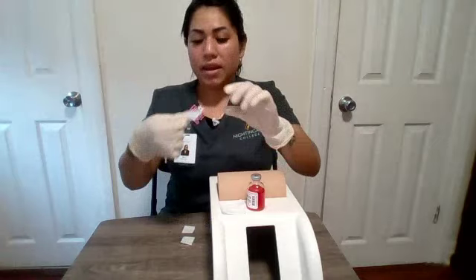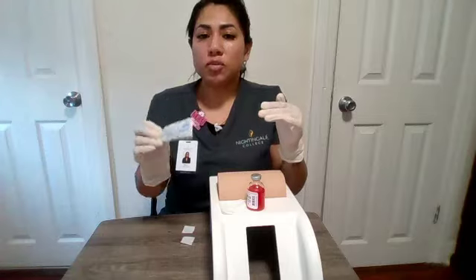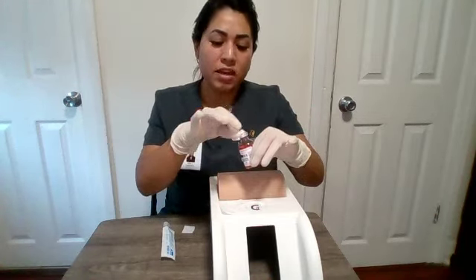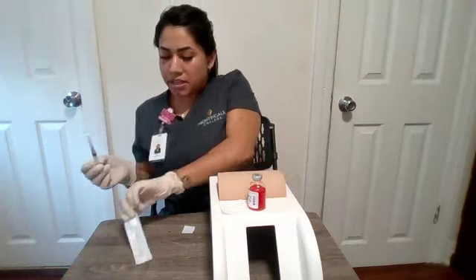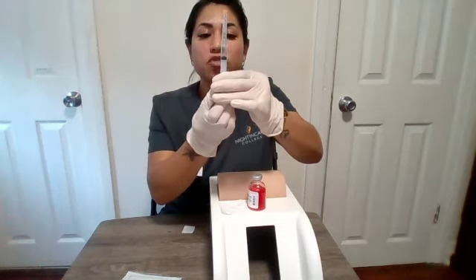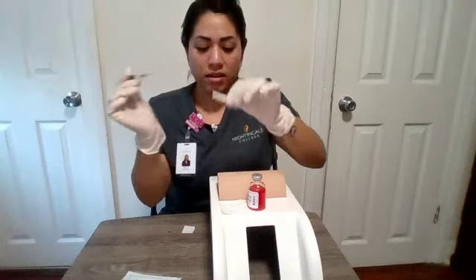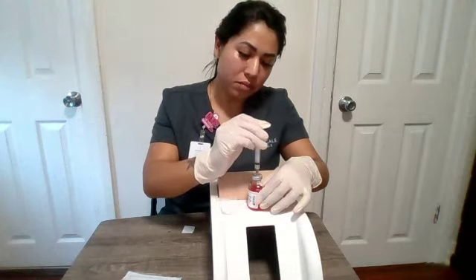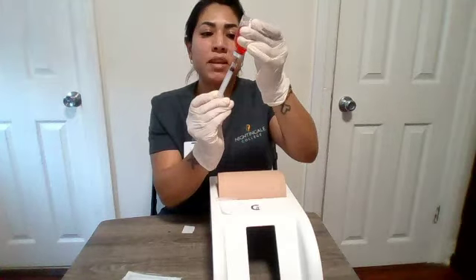Okay. Now I have my 22 gauge 3 milliliter syringe with a 1 inch needle. I am going to start off by wiping the top of my vial of medication with a clean alcohol pad. Then I will add 1.5 mLs of air into my syringe. Then I will release this air into my medication vial. Then I will withdraw my 1.5 mLs of medication.